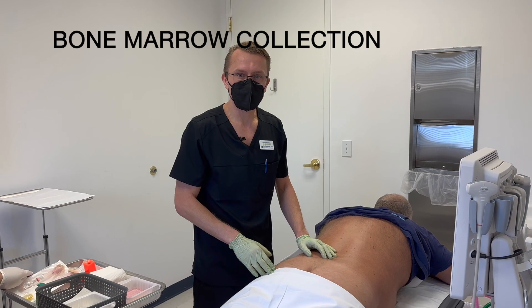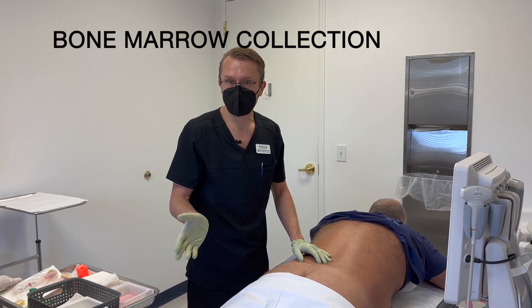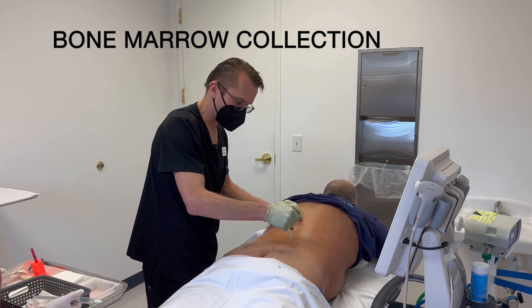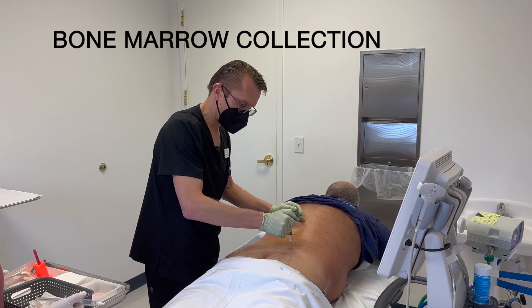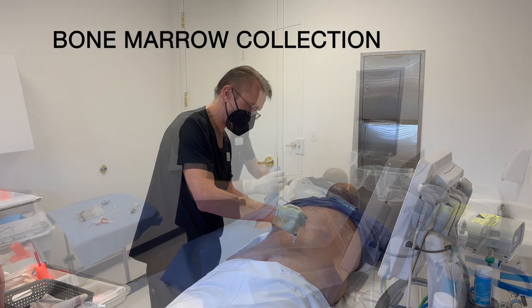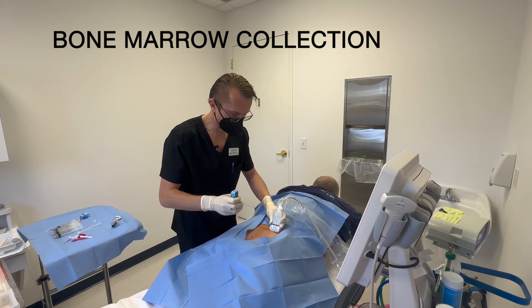First, I'm going to show you how we take the bone marrow from the pelvis, and then we'll go ahead and process it in our lab, and then we'll inject it into the joint. I'm going to numb up the harvest site with some ropivacaine and some lidocaine, and basically that's going to take away any of the pain during the procedure.